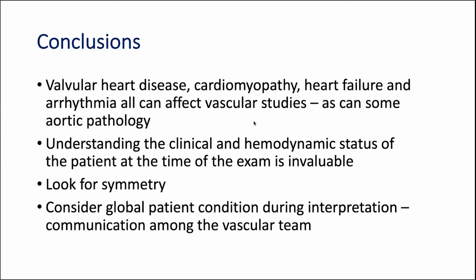The key to identifying the cardiac cause of flow abnormalities that we see is that symmetry. And depending on the type of unit you have where you're doing carotid diagnosis, physician sonographers, non-physician sonographers, and so on, the most important thing, like always, is communication among the vascular team to come up with the best diagnosis for your patient.